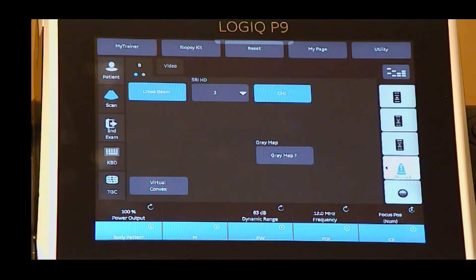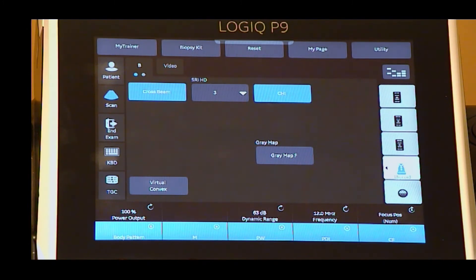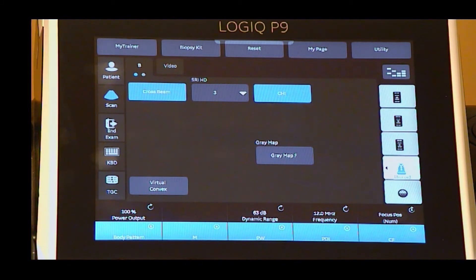CHI harmonics receives and displays two levels of frequencies: harmonic and fundamental. CHI increases contrast and reduces low-frequency, high-amplitude noise. Multiple frequencies are available to help increase penetration.